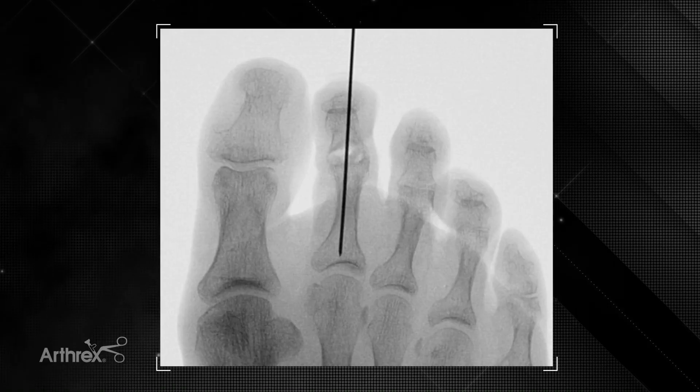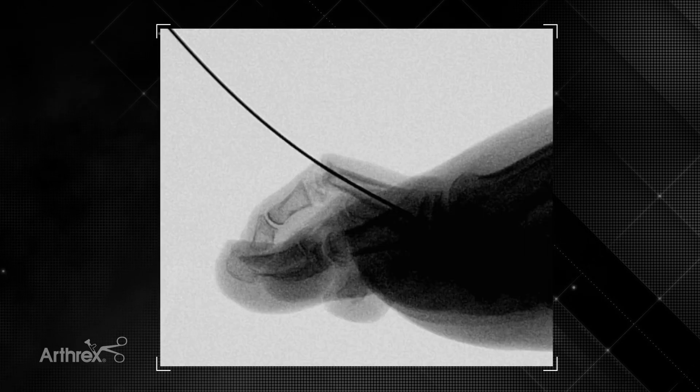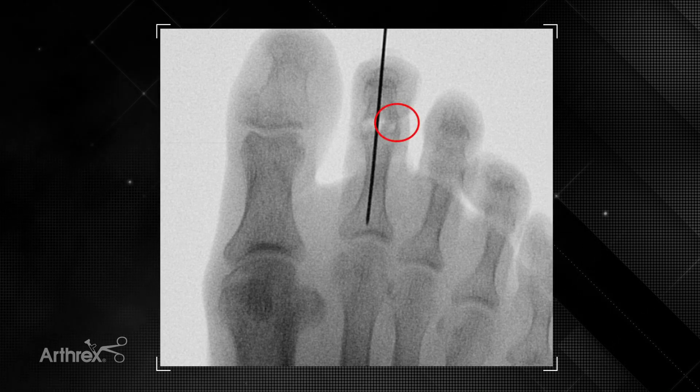On the AP image we can see good placement of the guide wire down the intramedullary canal. It's also important to check on the lateral image, and you can see it's right down the shaft. On the AP image we also see that our joint is unevenly prepared, so we're going to have to remove a little bit more bone from the lateral part of the joint, which can be done in subsequent steps.